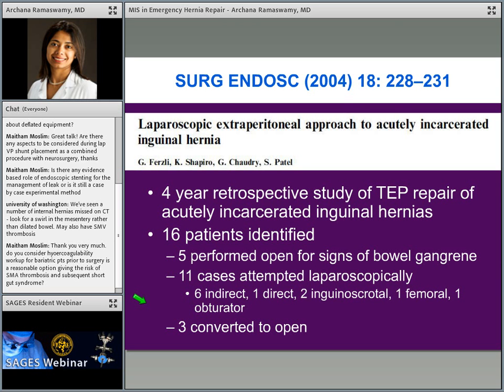Here you're starting to reduce. You see a little bit of redness, and you go, well, maybe that'll pink up as we move along. But then as you're reducing it more, you can see what is, frankly, a necrotic and on its way to being mummified bowel. And so here, this is not somebody that you're going to leave alone, and you are going to have to do a resection. So this video is going to completely cut off at this point because that decision could be made there.